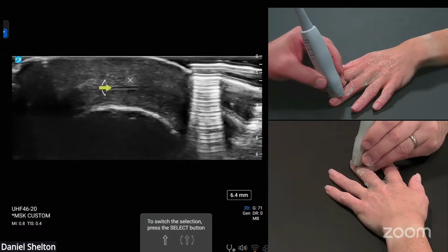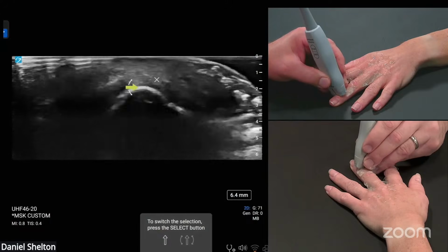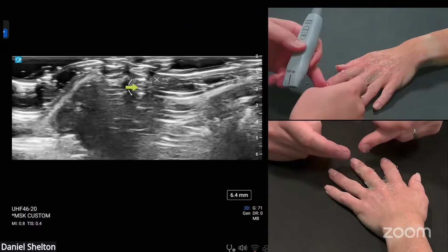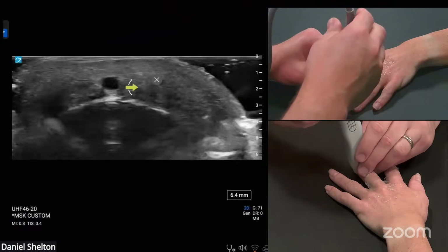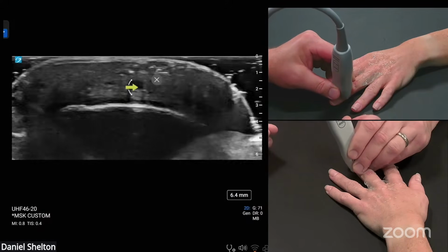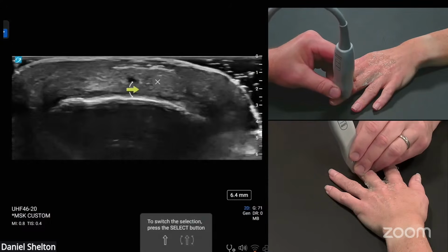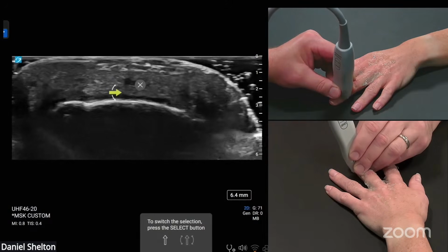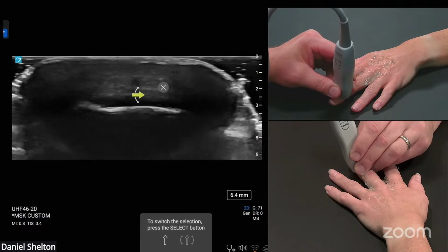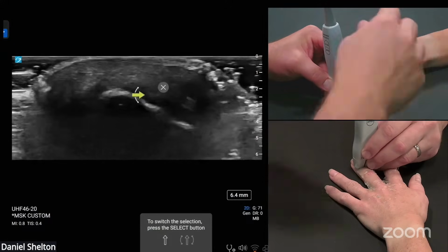What we're seeing here is the beginning of the nail. So we're at the nail bed, joint of DIP, and that's where we get that triangular ligament in the middle of the DIP area. These two tendons come together, and we've got that triangular ligament, which is just a little bit of fascia between the tendons that attach at the DIP level. So this right here where my arrow is, triangular ligament. It's traveling cross sectionally across the joint of the DIP, or proximal to the DIP. And then on each side are the tendons that go to the eventual insertions.